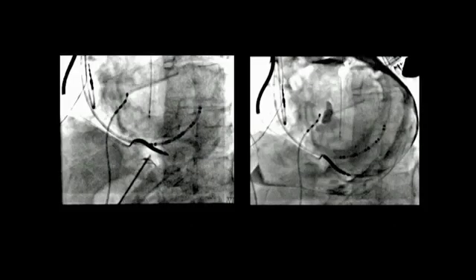So our technique is largely the same as described by Dr. Sosa and Scanavacca for VT, and which we use today. You can see in the left image the needle, percutaneous needle, in a subxiphoid approach. We typically use a posterior approach for access. The image on the right shows after we've gotten access, doing a pericardiogram to show nice free fluid movement in the pericardium to ensure that we haven't gotten into a cardiac structure prior to putting in the larger sheath.